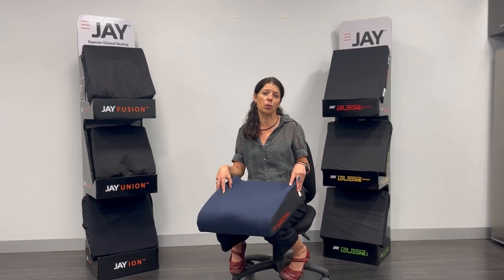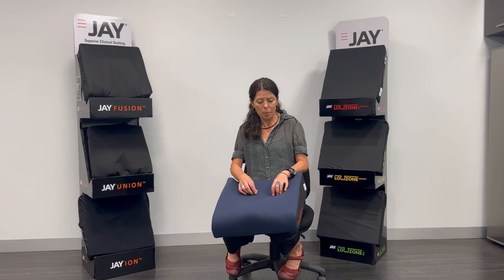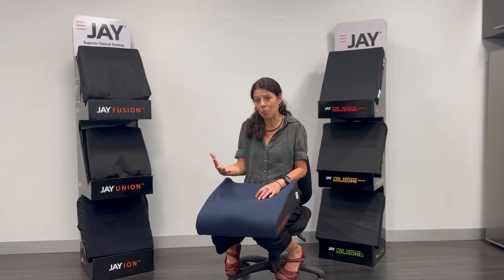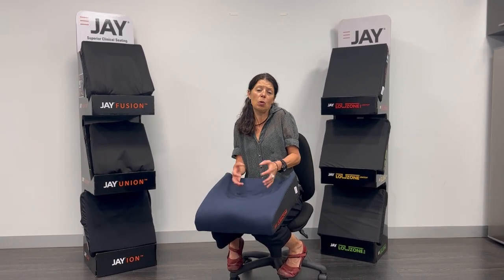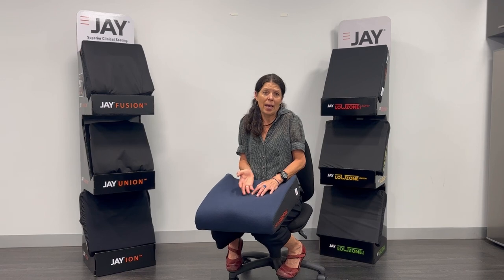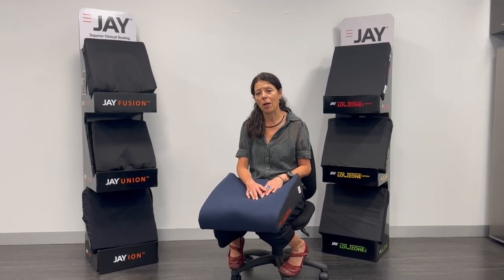First is what we call the cool-over cover. You can see it's a really nice, comfy fabric, but inside is a wicking and microfiber material that's going to dissipate heat if a hot butt sits on it, or give heat to the client if a cool butt sits on it. So it tries to keep a temperature of about 33 degrees.